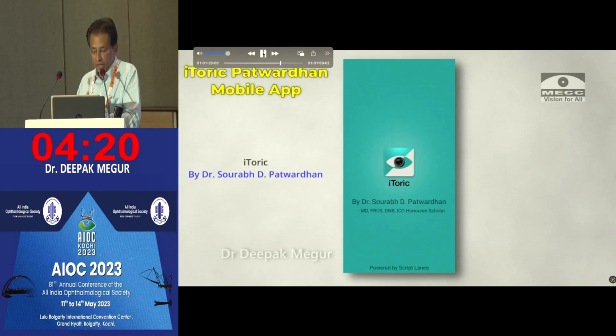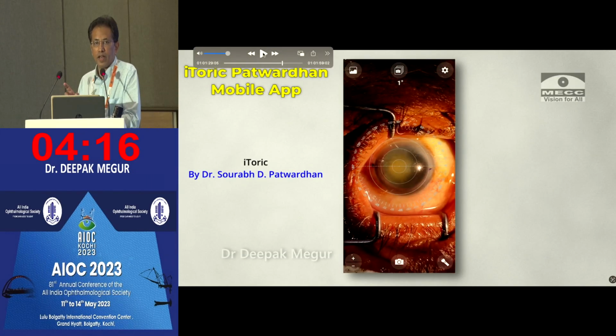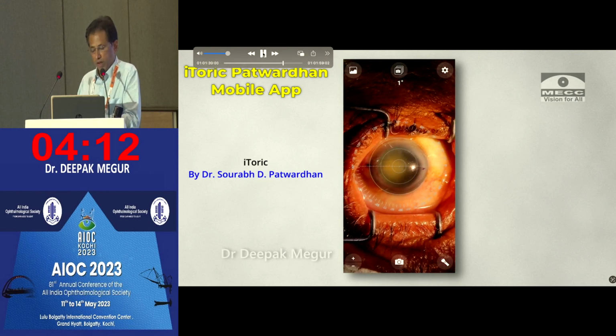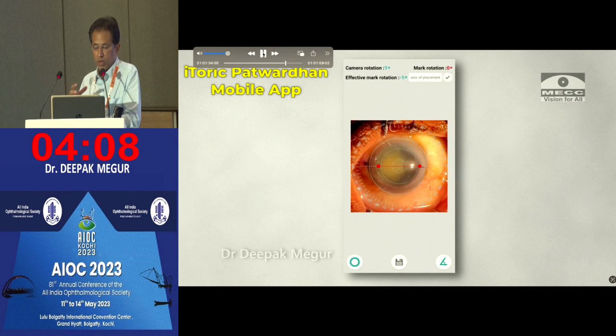So this is what I use. Again, the idea is, the patient is sitting at the slit lamp with good illumination. The head is stable. You get excellent photographs by using this. And you've got those rings, and the largest ring has to be aligned with the external limbus. And then you have got calipers, which you are going to align with the mark which you've done.